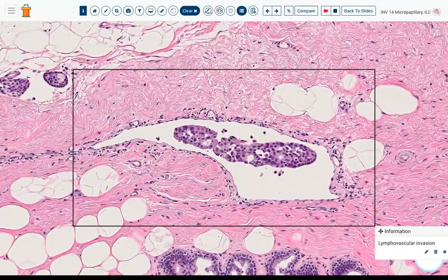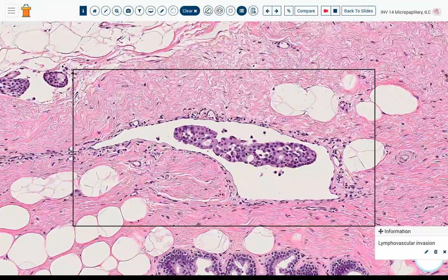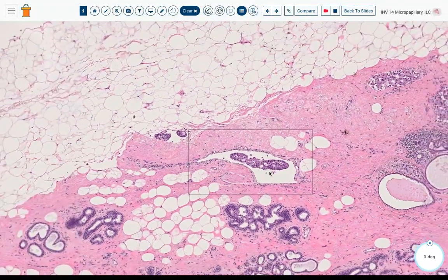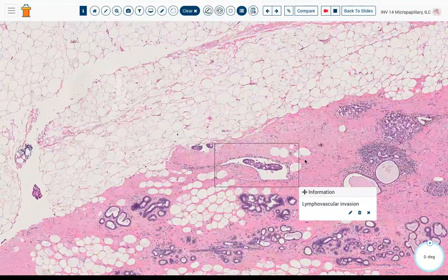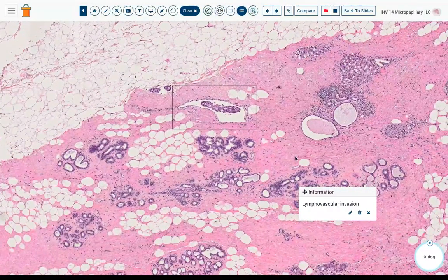And then here's lymphovascular invasion. Again, because this is anchorage independent growth, and you often see these structures in pleural fluids, they're probably very capable of living in lymphatics. And so it's also very highly associated with lymph node metastases. So this is a relatively poor prognostic special type.